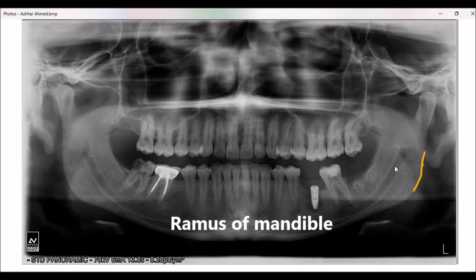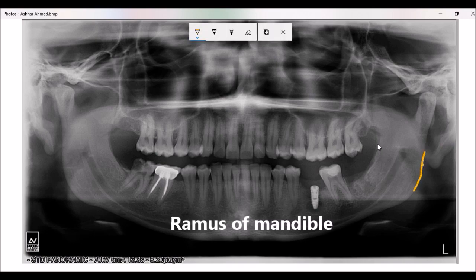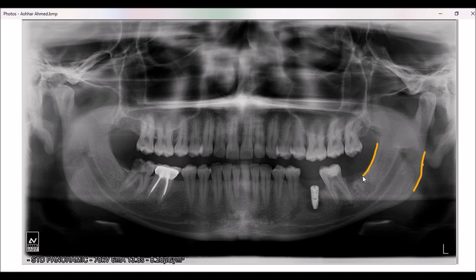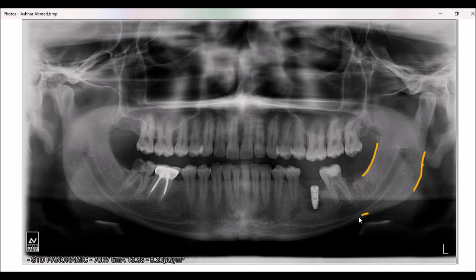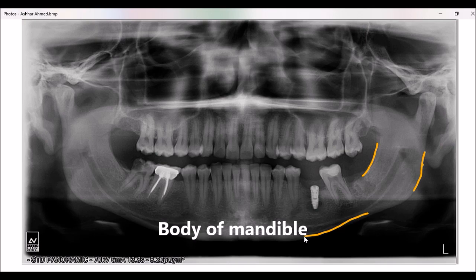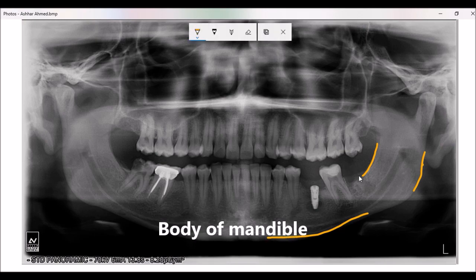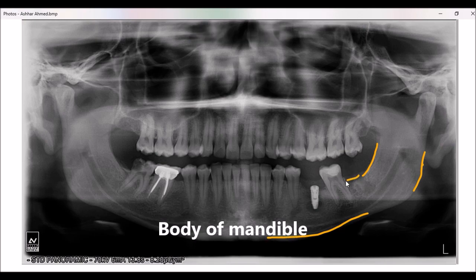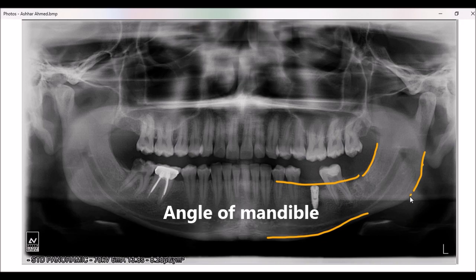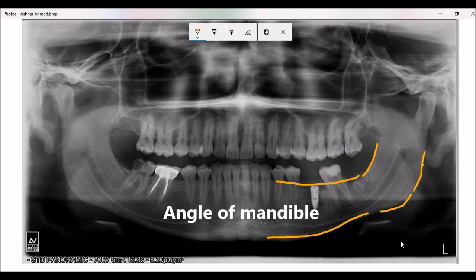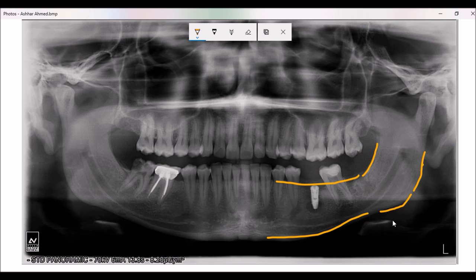This portion is the ramus of the mandible. This is the angle of the mandible.